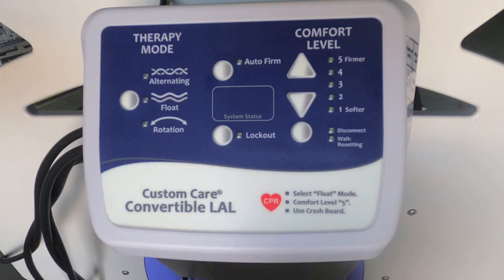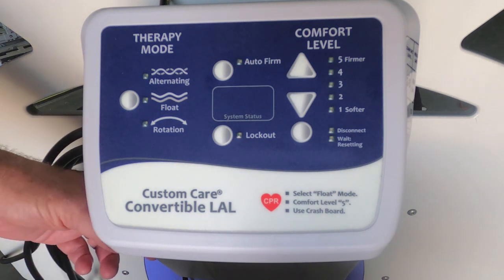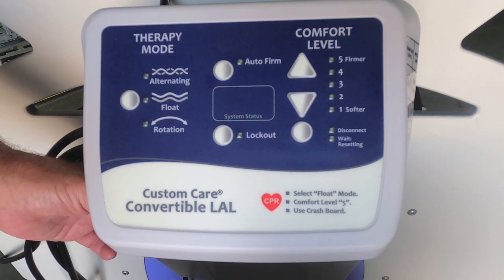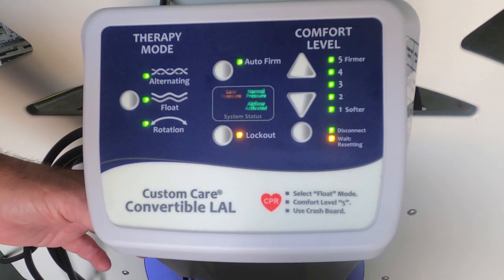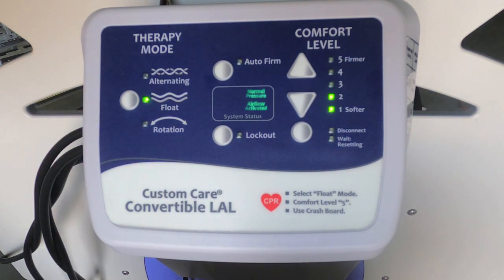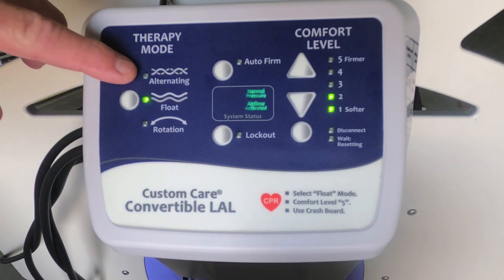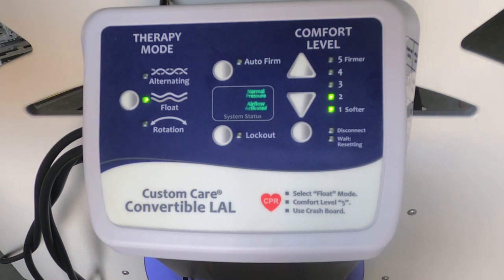The first thing you want to do is turn the unit on, and that's with the power switch located here at the lower left-hand side of the controller. You're looking at the controller now. You can see the lights come on the control panel. They all come on for a few moments and then go out. The system automatically defaults to what's called the float mode. There are 3 modes of operation here: alternating, float, and rotation.